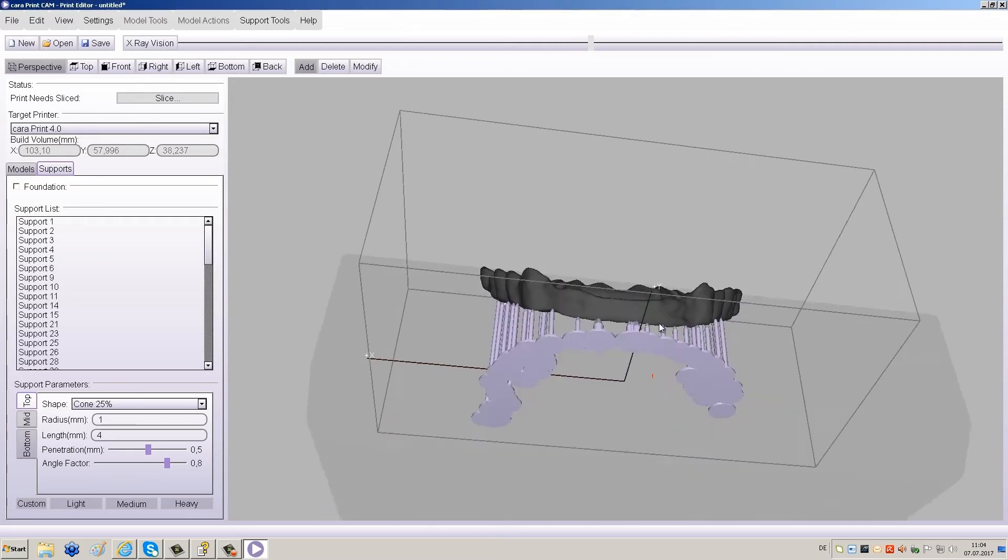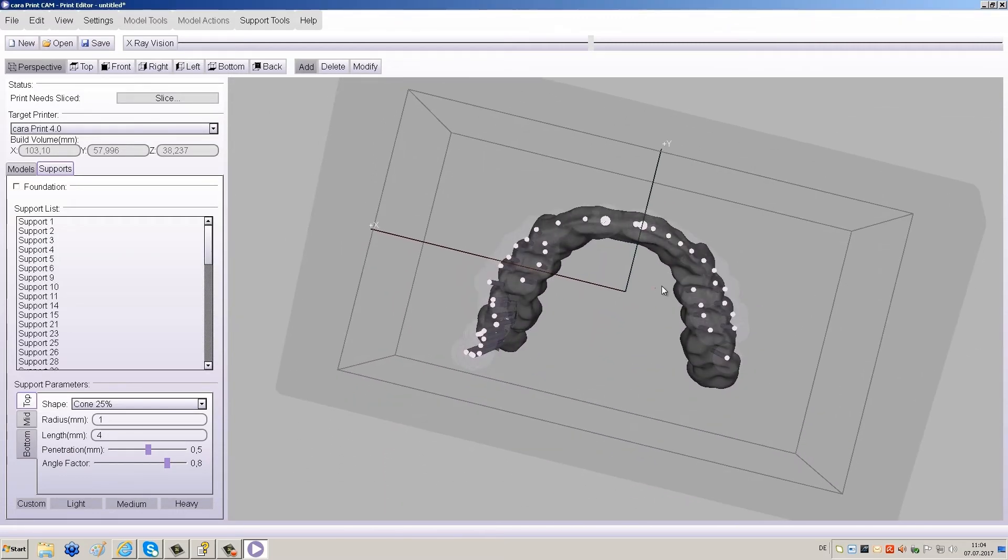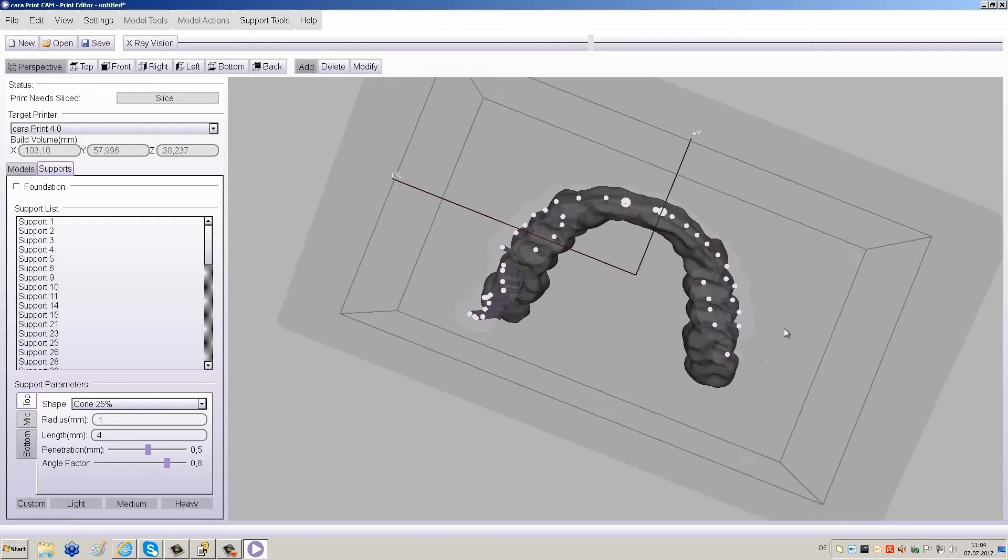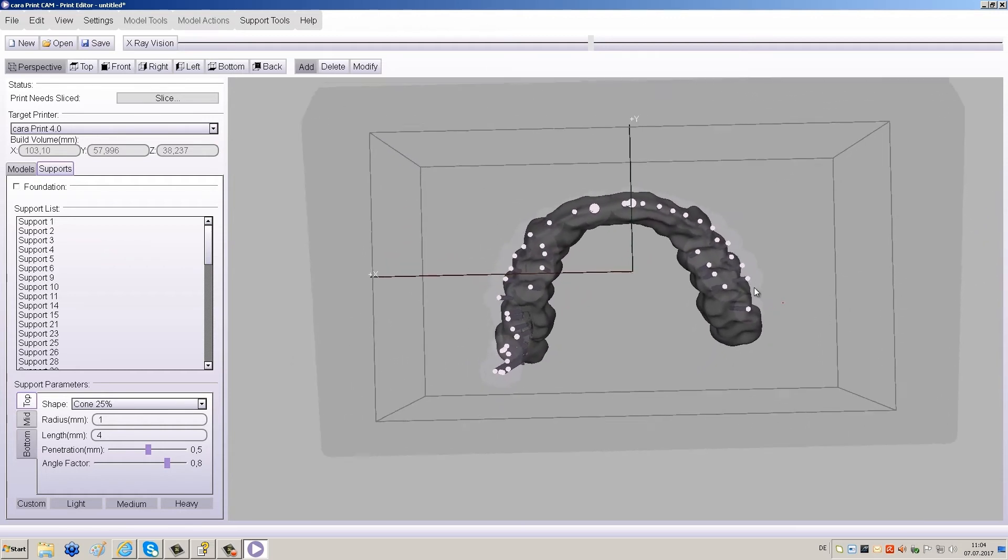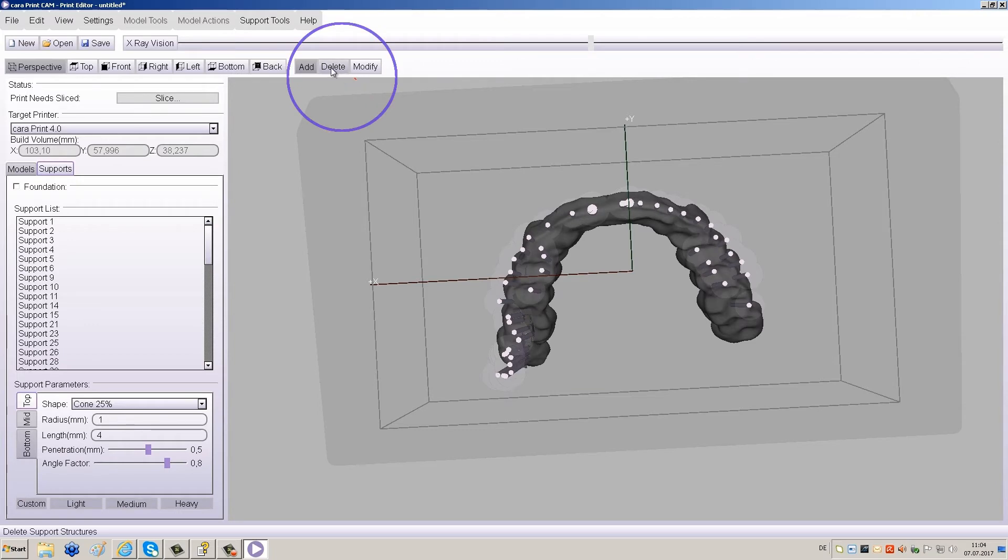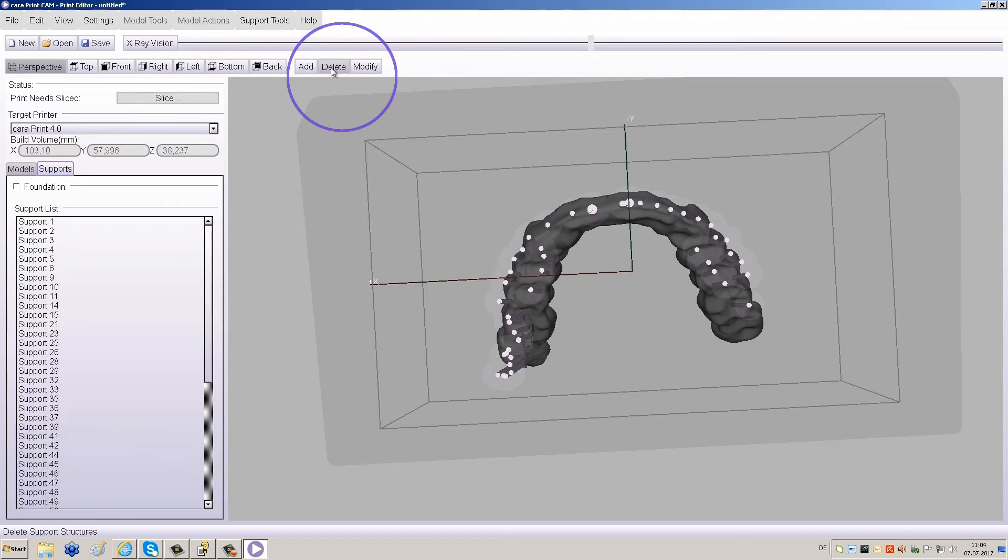Review the results from various angles. Check if manual corrections are necessary. Delete any supports that might be too thin at the terminal areas of the restoration. First click the Delete button, then click on the individual supports to remove them.